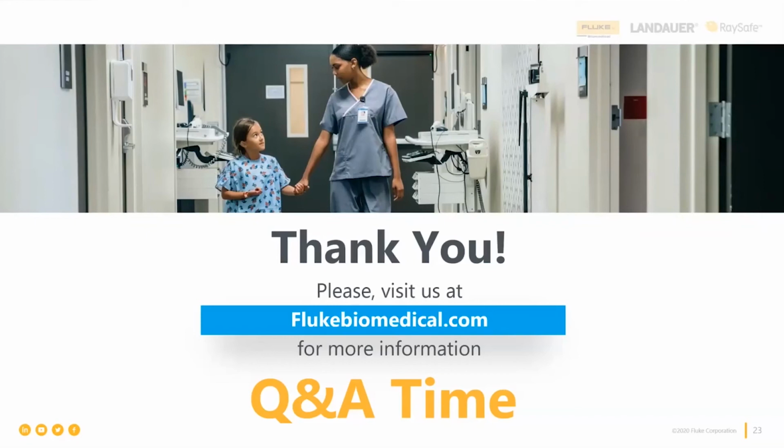Okay. So first of all, there should be a section in the service manual of that AED, by the way. No matter what the manufacturer says, there should be a section that describes this. But basically, here's what I do when I look at an AED or a shock advisory defibrillator of any kind. I want to see, number one, will it shock a non-shockable rhythm? Yes or no? And so what I want to do is give it a non-shockable rhythm, like normal sinus rhythm, which should not be shocked by an AED. It's as simple as that.